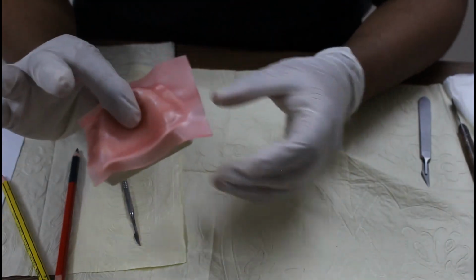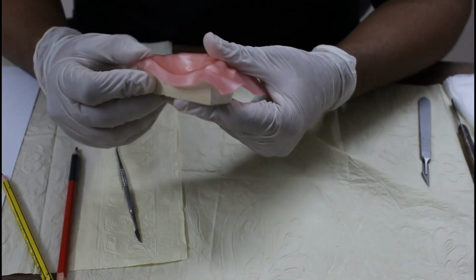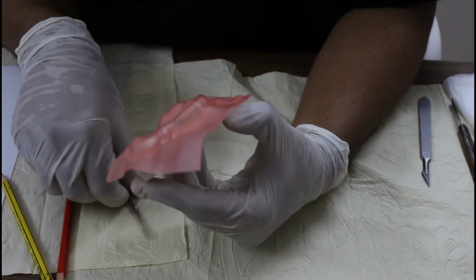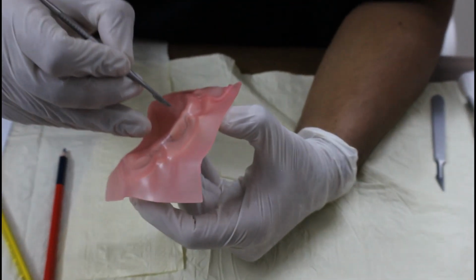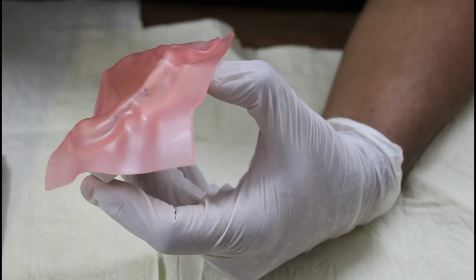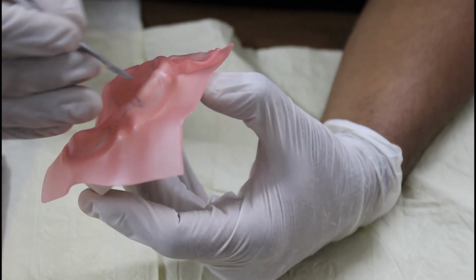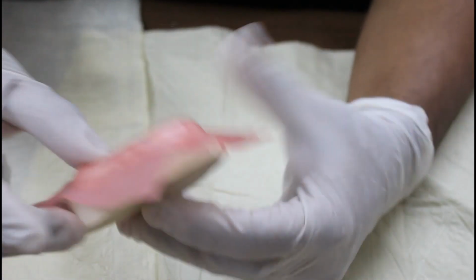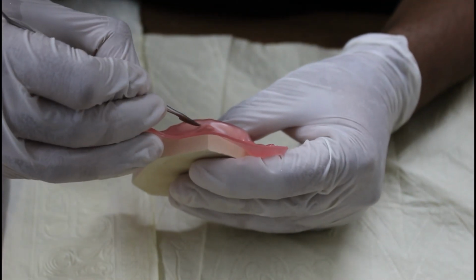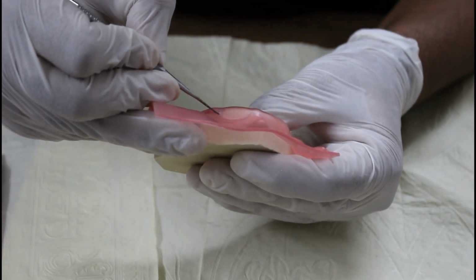Now it is extra. We have to cut it. So now cut it from where? Now you can easily see the blue color line on the cast through the wax. This is the spacer line, the topmost line. We intentionally made it with blue color so that we can see it from the wax. So take your carver and cut the wax till your blue color line.